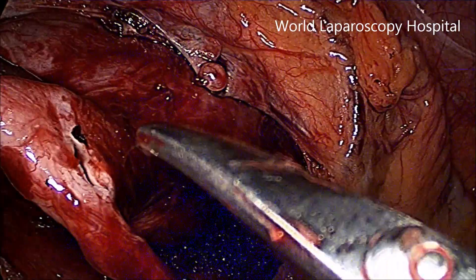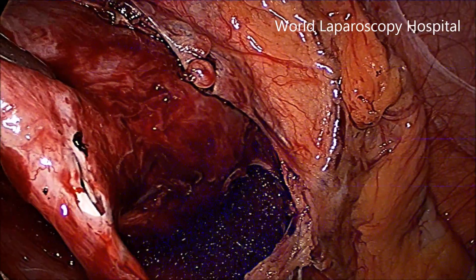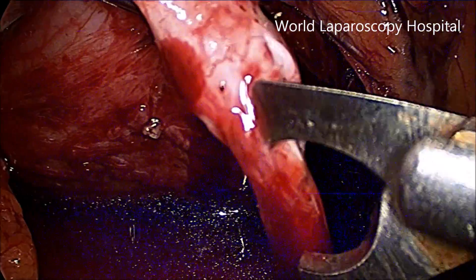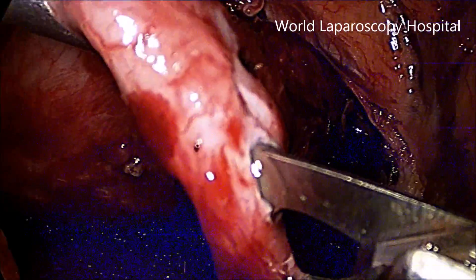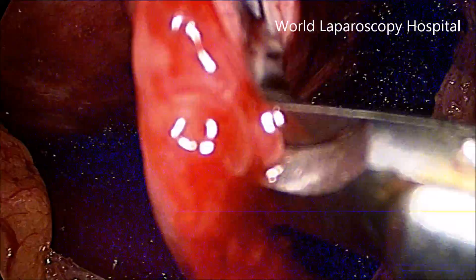Now here longitudinally the ureter is cut, the stent is now starting to become visible, and here the hook scissor is used just to enlarge the incision. The hook scissor has the advantage that it will engage itself and there is no chance of slippage.